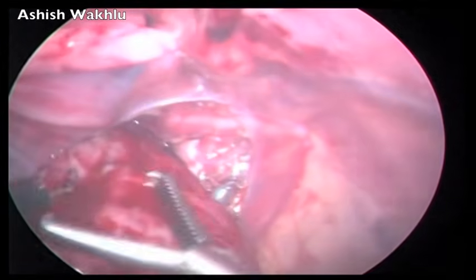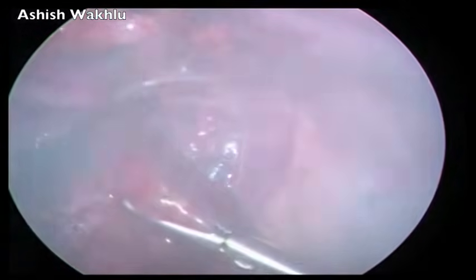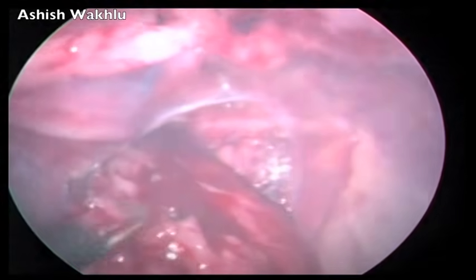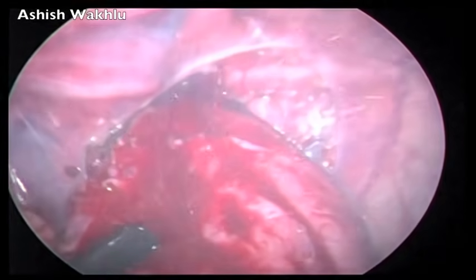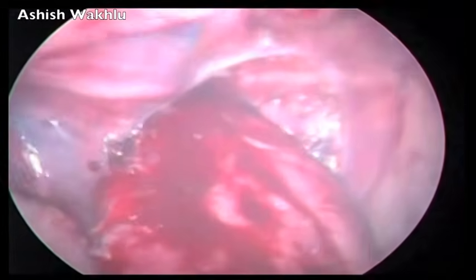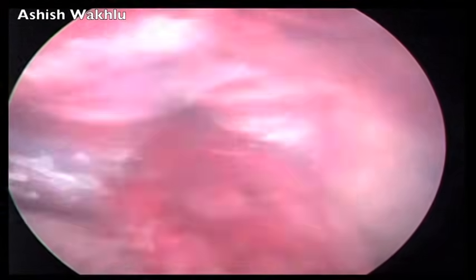This bleeding is a result of one of the surface vessels of the rectum getting torn by the teeth of the grasper. One should be careful to grasp the rectum at a point away from a vessel. However, with bowel of this size, sometimes manipulation causes this kind of bleeding, which of course in a magnified view looks far more than it actually is.